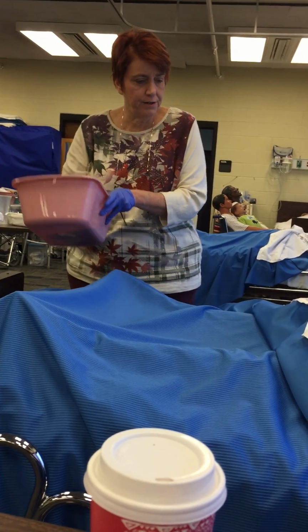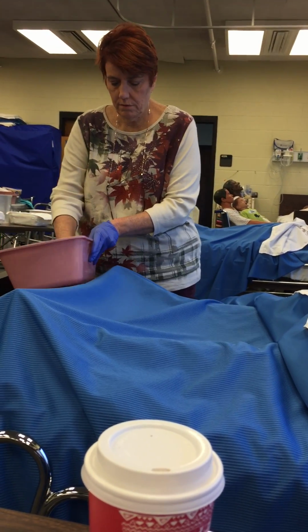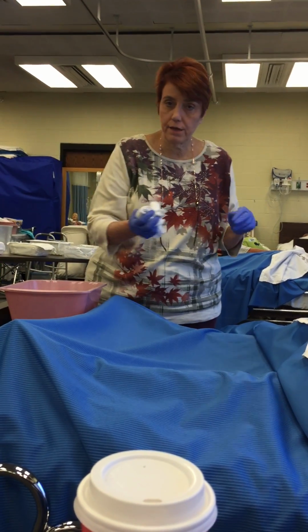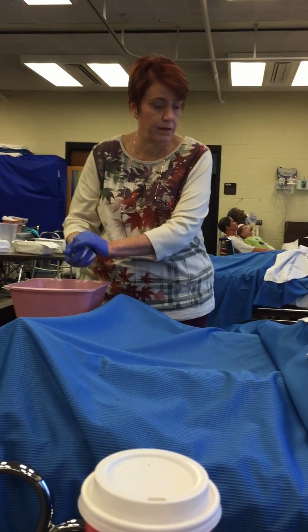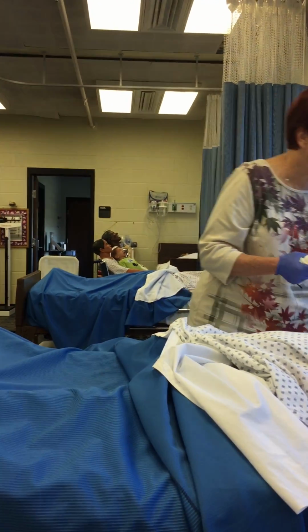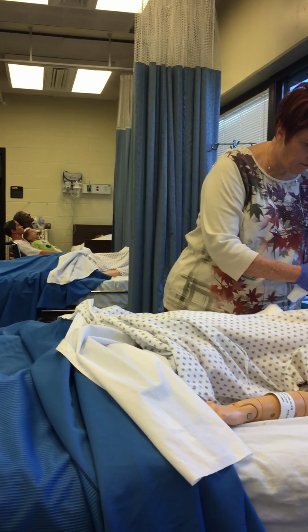Some soap and water here. Of course, for pericare, you would use soap and water. The hand sanitizer is not an acceptable form of pericare. I'm going to raise your bed.